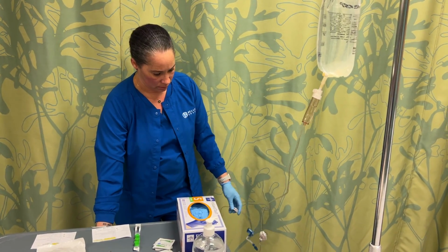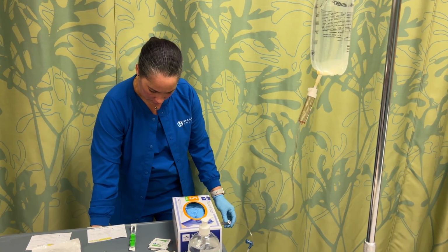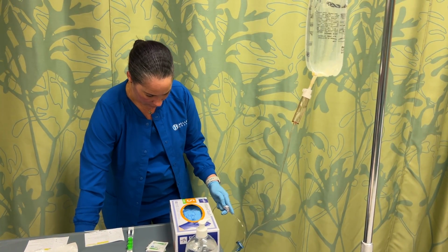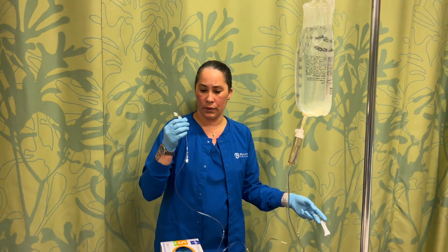So we're giving this at 125 mils an hour. The drop factor of this is 10 drops per milliliter. So that's going to average about... Okay, so this is all primed and ready to go.